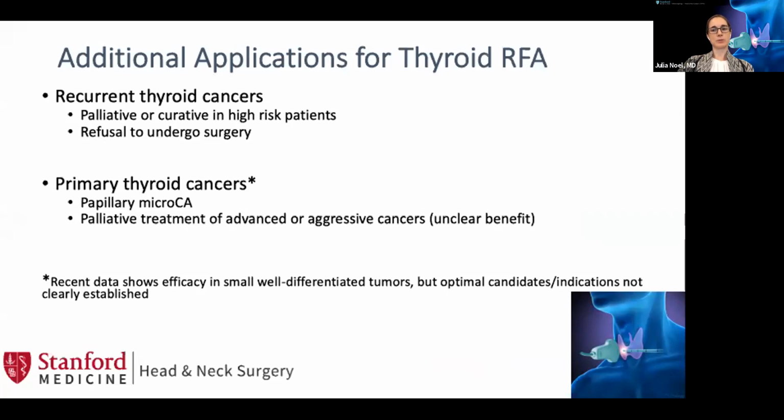So although we don't currently have guidance on the indications in treating primary malignancies, I suspect this will be incorporated in upcoming guidelines. And there have also been case reports or case series about using this technology for symptomatic improvement in patients presenting with advanced or aggressive tumors, but the tumor and symptom response is very variable, and so lends to an overall unpredictable result.